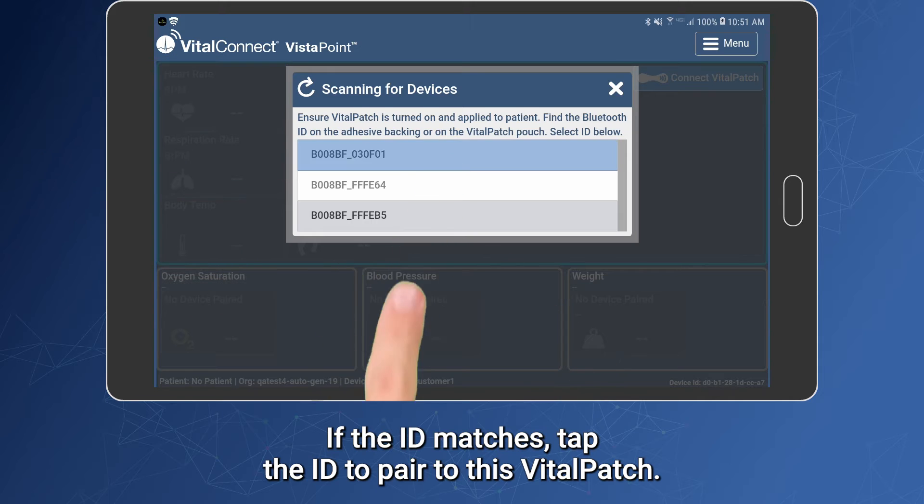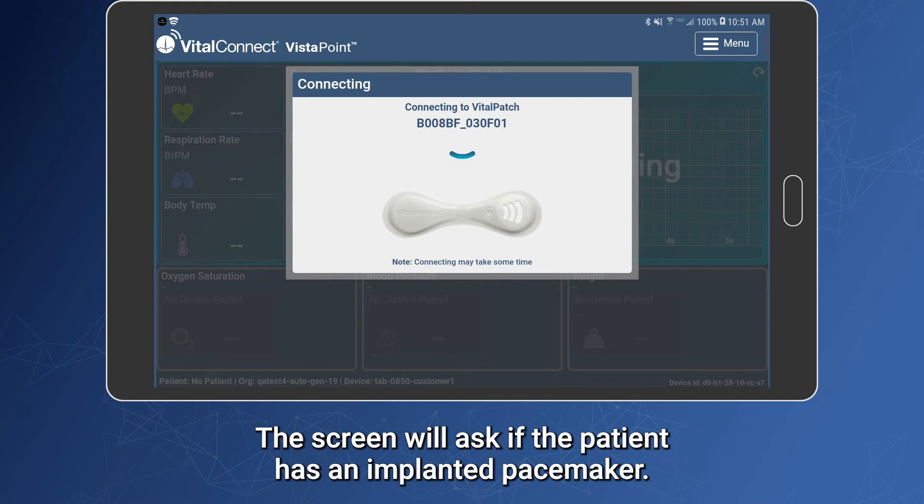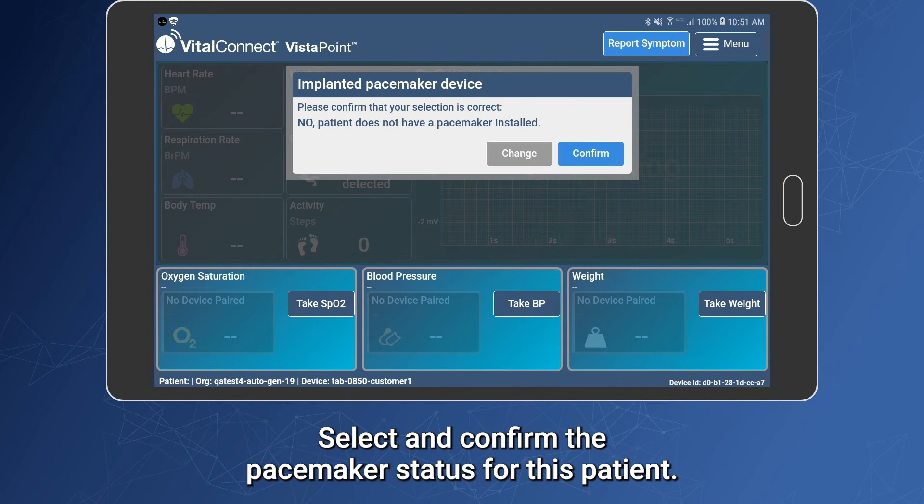If the ID matches, tap the ID to pair to this Vitalpatch. The screen will ask if the patient has an implanted pacemaker — select and confirm the pacemaker status for this patient.